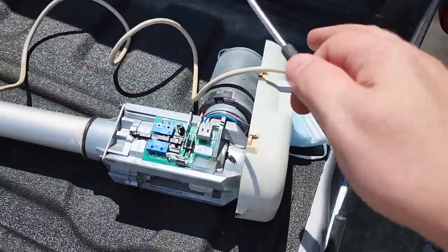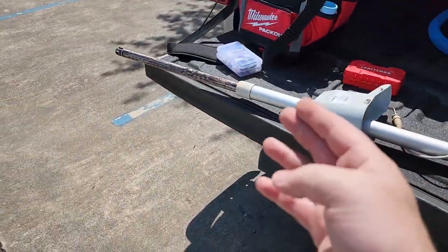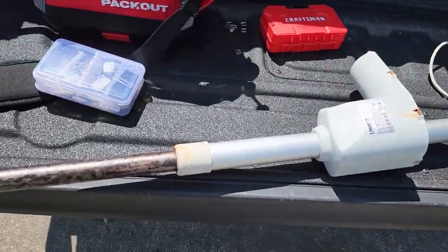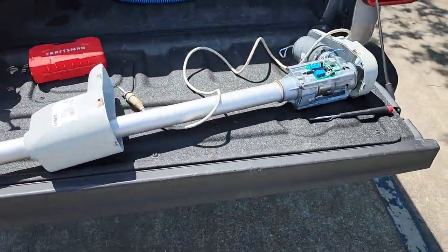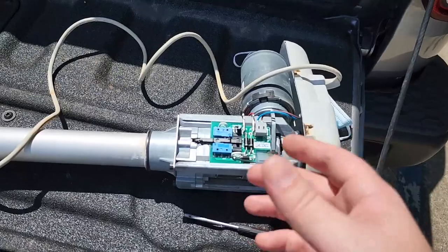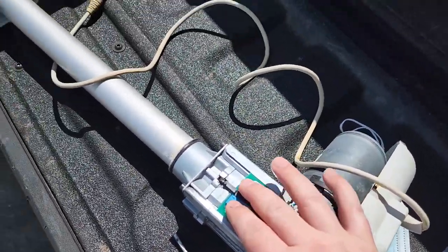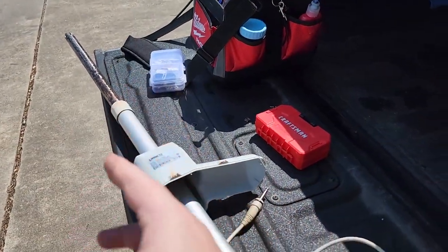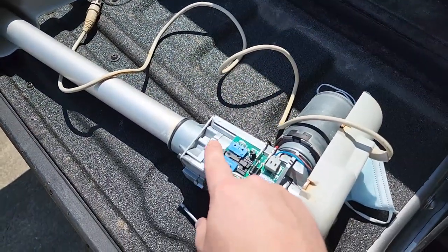So guys, this is fixable, but I'm probably gonna price out the part regardless. I will probably get it back up and going, but I'm also gonna clean off all this extra rust, which is why I'm out here in this noisy parking lot, because I don't want to clean off a bunch of rust and stuff next to the pool. So I'm gonna do my absolute best, separate the clamshell right here, wire brush it down, clean it up, and it should be functional. Hopefully there's nothing broke when I separate this clamshell. We'll find out in just a minute.